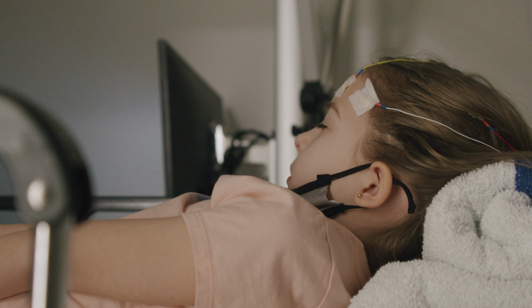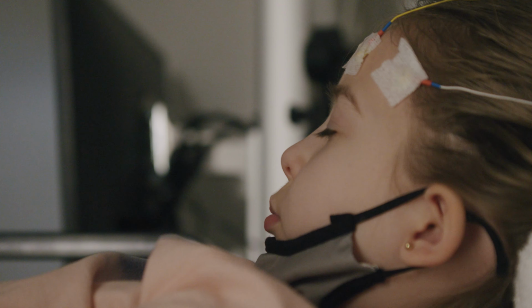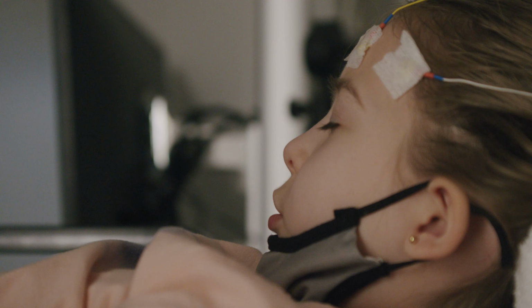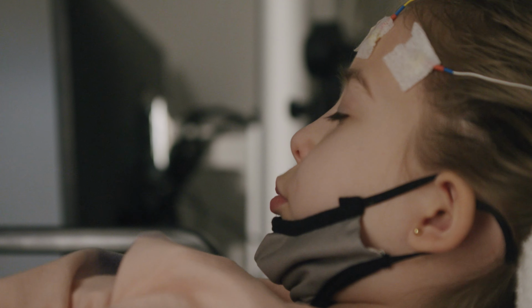Hyperventilation is an activation where we have the patient breathe in and out through their mouth like they're trying to blow out a candle to kind of increase the heart rate and blood flow and change the oxygen CO2 mixture as we monitor the brainwaves.